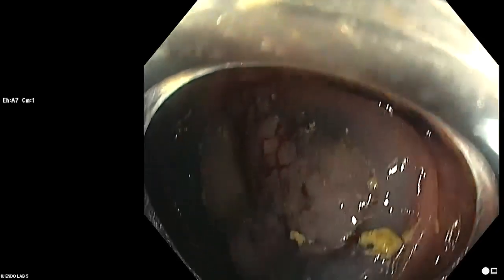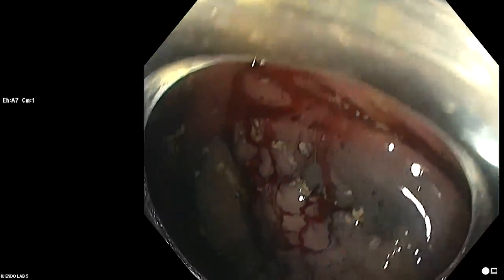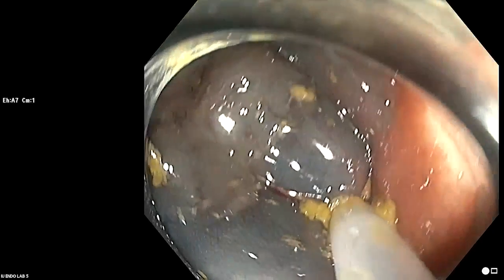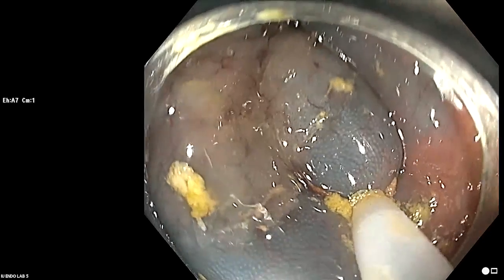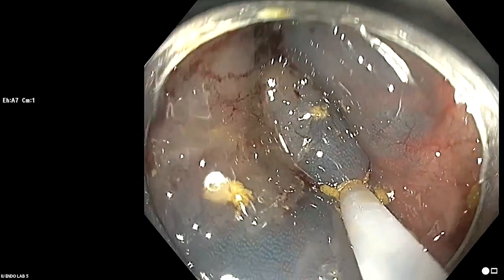Yeah, Doug, Brett here. I think a lot of us are moving to cold from your training of the last couple of years. And I'm not sure that's penetrated broadly, but it certainly is fast and easier. We're generally seeing lesions a little bit smaller than this one, and cold works so well. Yeah, thanks, Brett. So the key thing is a margin. So we're starting off with maybe 5-6 millimeters, close cut, John.